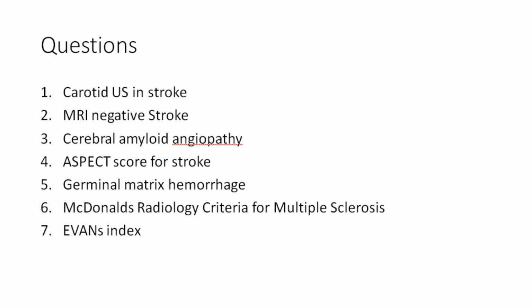Unless MRA is not available, time of flight, okay, then you can do it, or maybe some other reason. I, as a neurologist, do transcranial Dopplers in the US, but I don't practice that routinely. Again, unless needed, otherwise you can just guide the patient. I know sometimes clinicians, this is a wrong practice. So you can just call the clinician, you think carotid ultrasound is really necessary? I know patient will not be paying you for this extra job, but it will save time for the patient. And you can just tell the clinician that the CTA would be better.